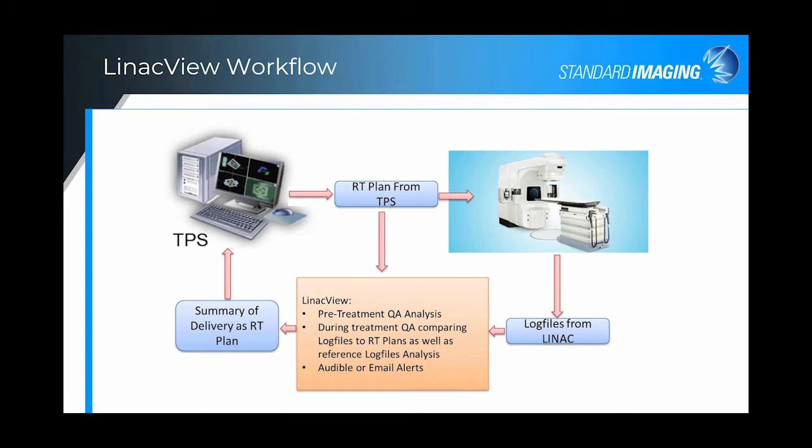So the first thing I'm going to start with is what is the workflow like for LinacView, and what exactly is LinacView? LinacView is software that one exports RT plans from the treatment planning system to. At the same time, those plans are exported to the linear accelerator. And then LinacView is always monitoring and waiting to receive log files from the Linac. So it's a log file based plan QA system.